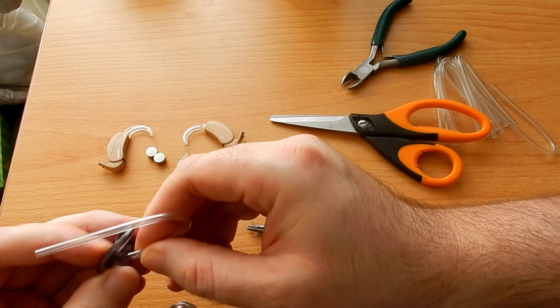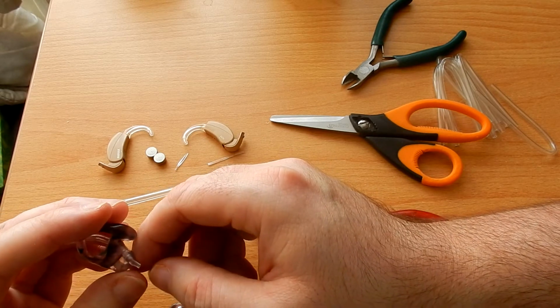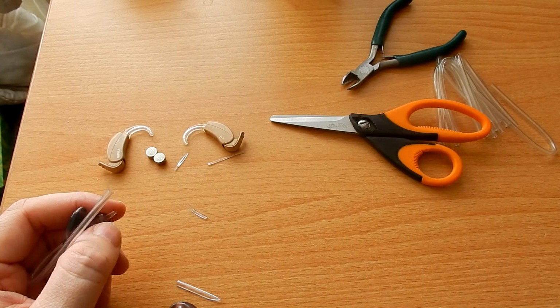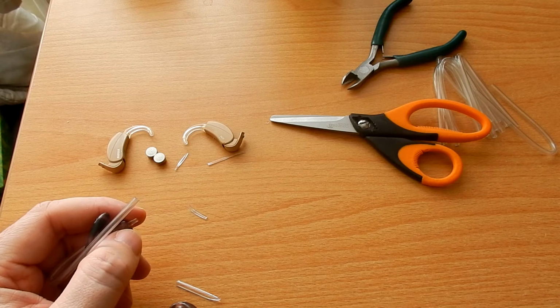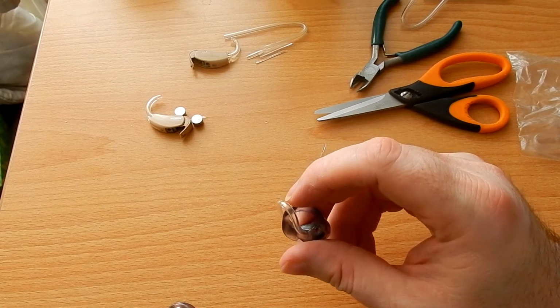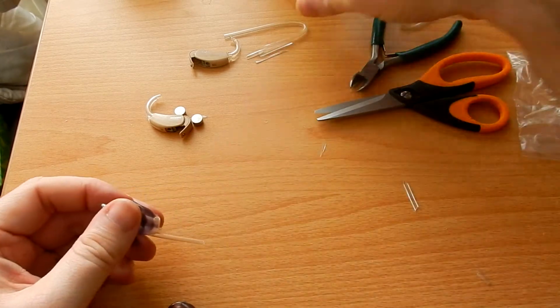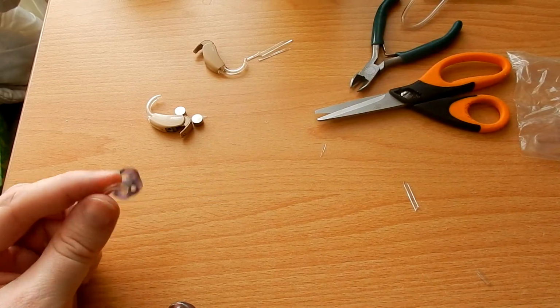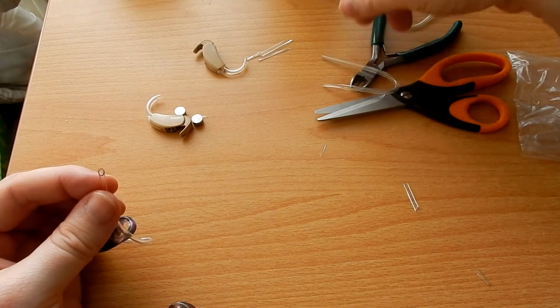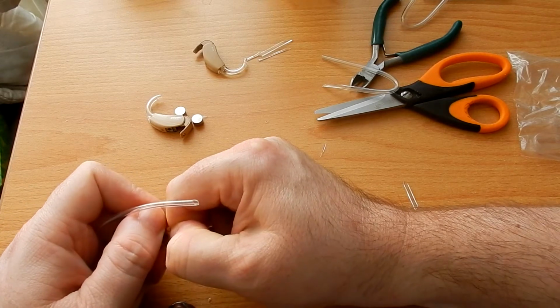I'll just pause it for a moment so I can try and do this. Okay, the tube that I was using was a bit thicker in diameter than what was taken off. Fortunately, I had some thinner diameter tubing, so I'll pull this through and show you what to do next.